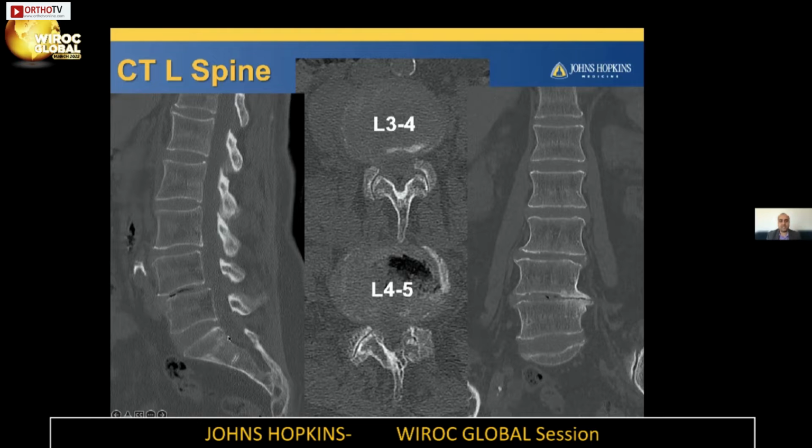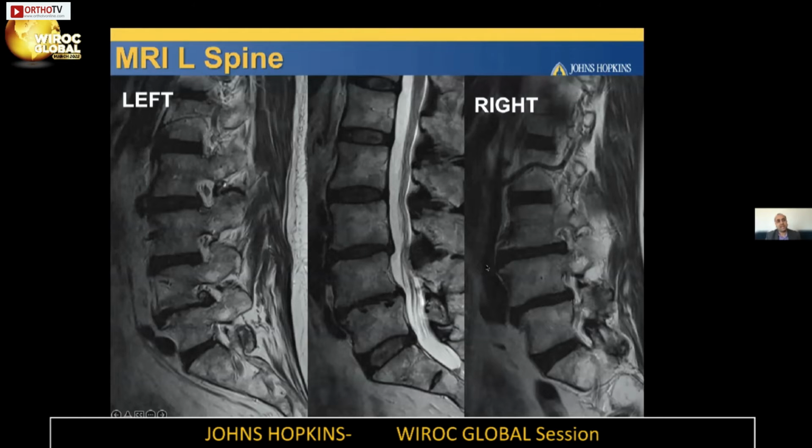So L4-5, grade 1 spondy with a vacuum air sign. At L4-5 you can see the degenerative changes in the facets, and then L3-4. Interestingly enough, I always like to look at the coronal pictures on the CAT scans because I find them very helpful. In this scenario they showcase asymmetric disc collapse at L4-5 with osteophyte formation, as well as at L3-4 a little bit of a lateral listhesis. That to me is pathognomonic for the pain generator. So really important to look at that.